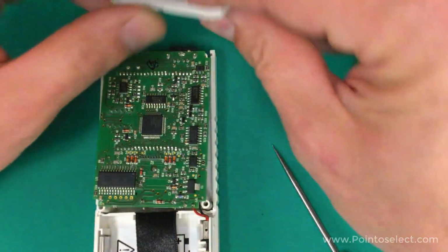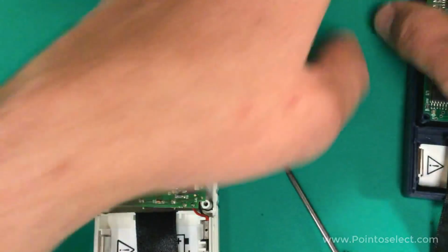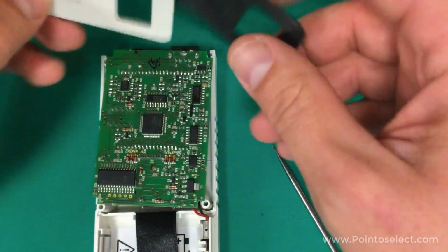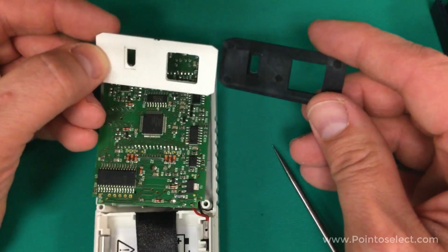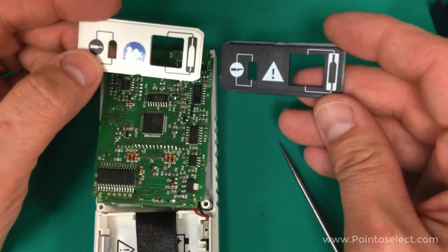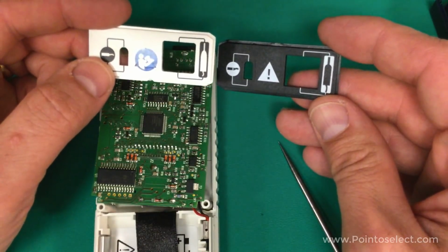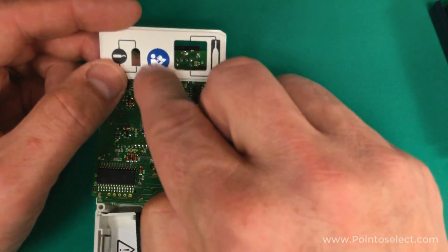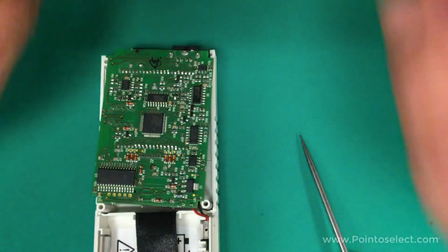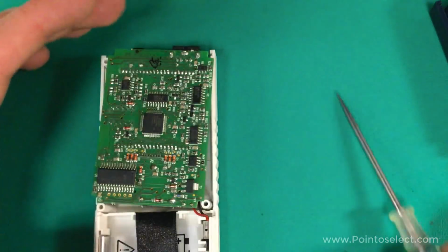And since this came off, okay, that's interesting. So yeah, these two are precisely the same. The silk screening, one is black, one is white, same symbols. Looks like there's a blue sticker right there they put over that, telling you to read the manual. If you read German, that'll help.